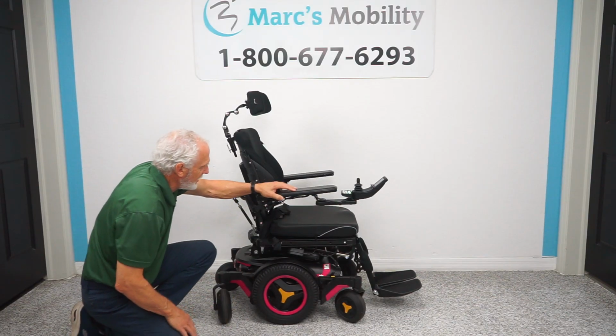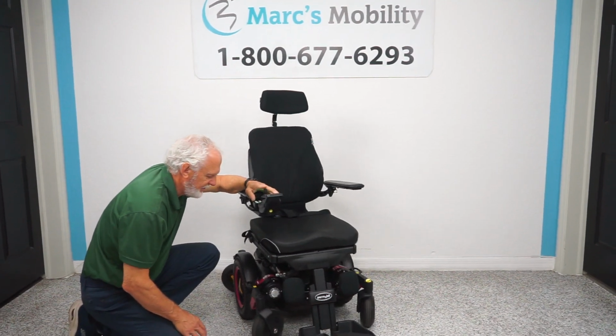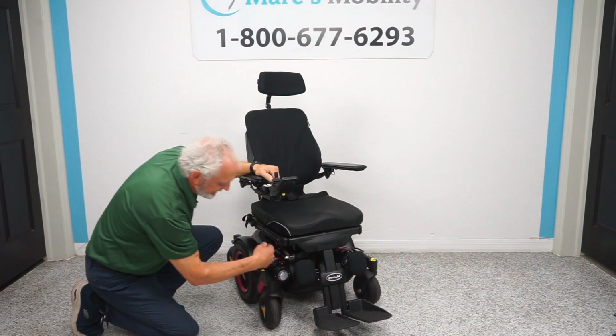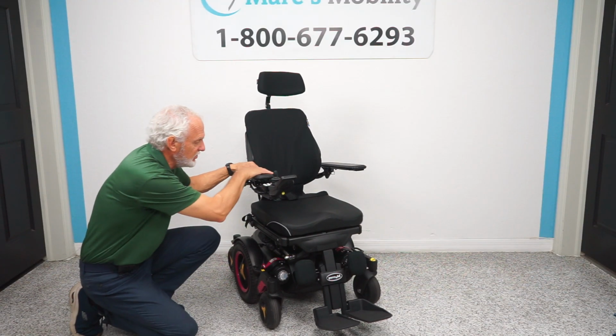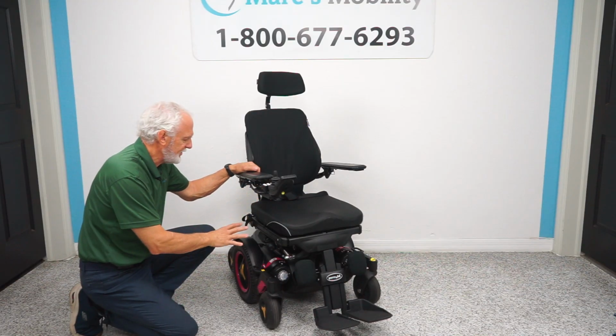I want to show you the motors. Let me show you the motors. You might be able to see that from there. Right here, this is your right motor, and the left motor is the same on the other side, okay? If I wanted to push this chair, well, let's just say you had an issue 10 years from now, you need to push it. Turn the power off, and the reason you want the power off, these are electric motors.